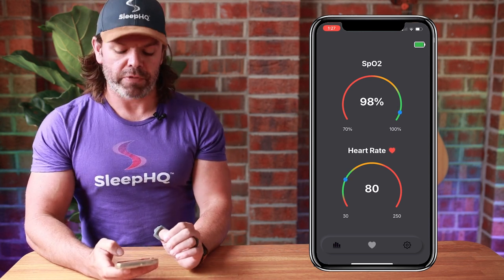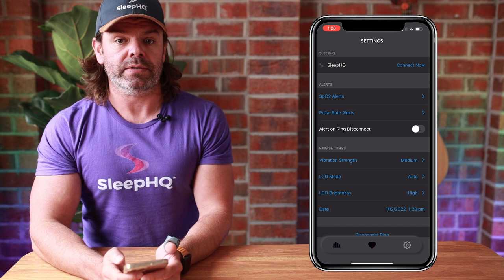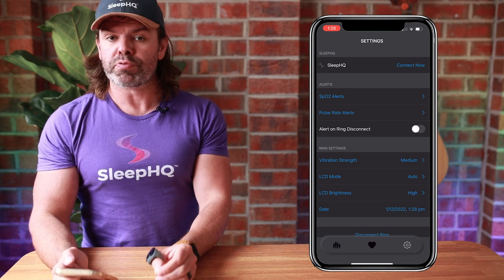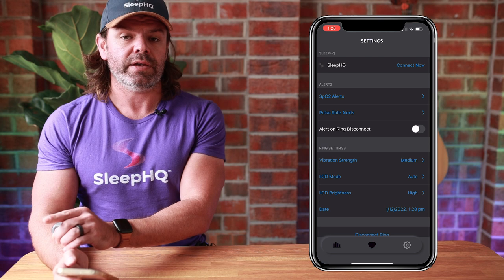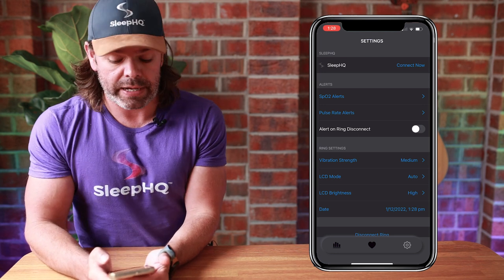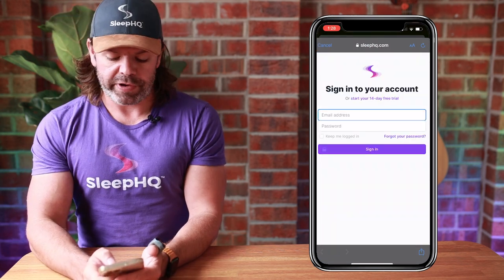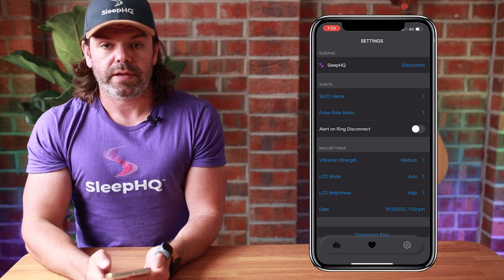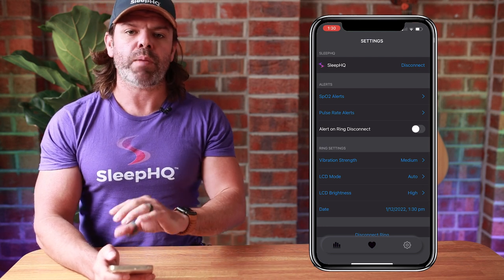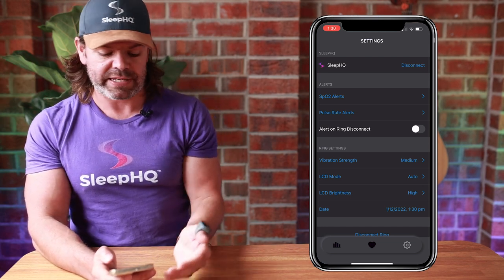Now let's move across to the settings tab. At the very top it says Sleep HQ Connect Now. Sleep HQ is our CPAP data analytics and reporting platform, and those with pro paid memberships can connect their Sleep HQ account via the SleepO2 app and import all this data to view alongside their CPAP therapy data. Just click Connect Now and log in with your Sleep HQ credentials. In the morning when you take off your ring and the data downloads to the app, it will push that data up to your Sleep HQ account so you can view it alongside your CPAP therapy results.